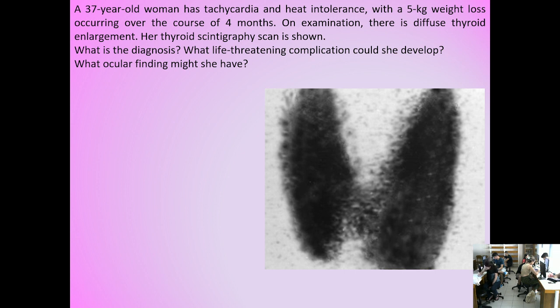So, since the thyroid is so hot, that means it takes up the radioactive iodine. What do you understand as far as its function is concerned? How does the thyroid function if you have such a scan? What do you think? Yes, please. It's normal because the thyroid takes up the iodine. Yes, but it takes too much of it, and it takes it in a diffuse manner. That means everywhere.